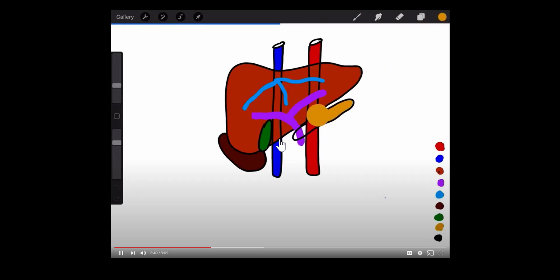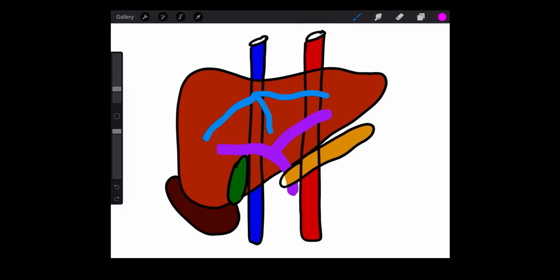Now there are 14 basic images that you will be taking with the basic protocol that I'll be presenting today. So as we're preparing to image the liver, we want to make sure that we are sweeping all the way out, all the way past the visualization of liver parenchyma. Then we're going to go ahead and optimize our images to the correct depth and settings for the left lobe.